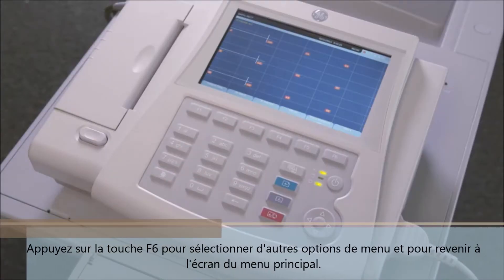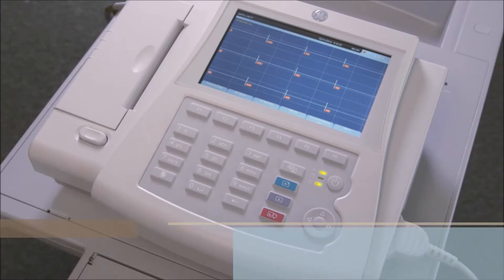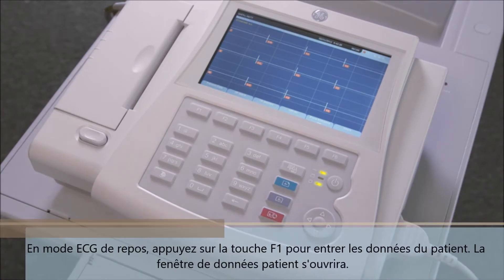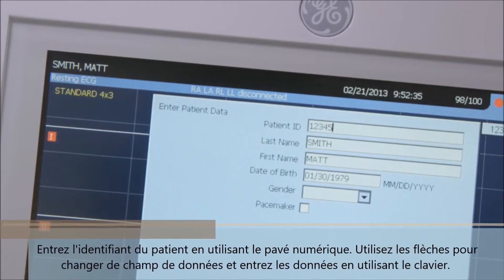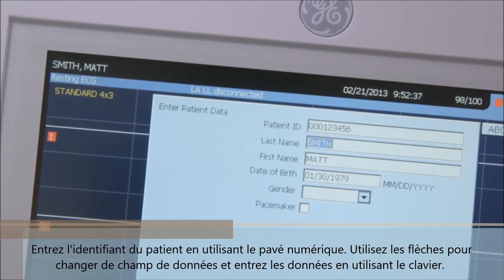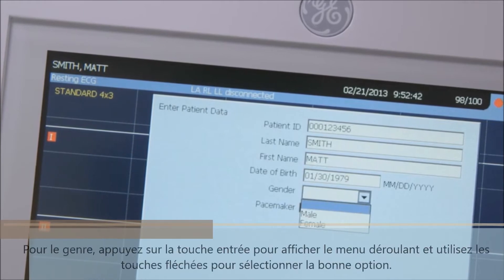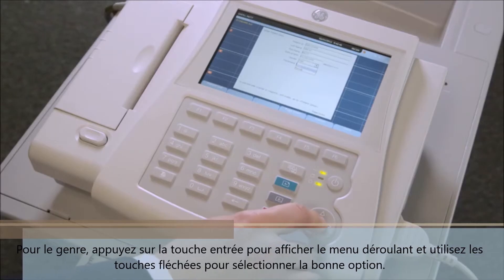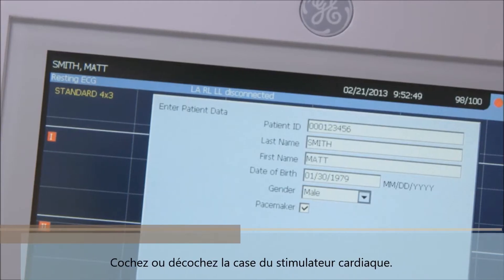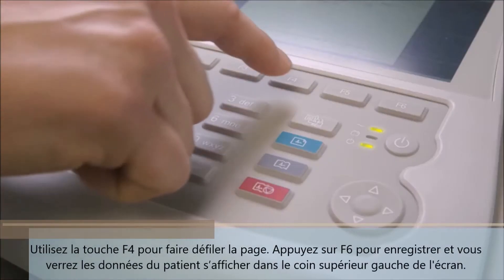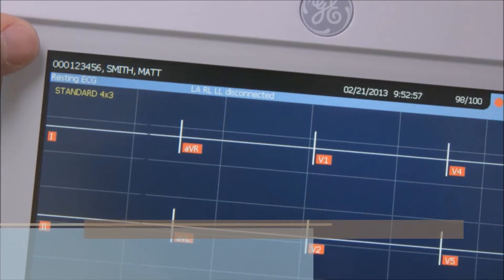Press the F6 key to select more menu options and also to return to the main menu screen. While in the resting EKG function mode, press the F1 key for patient data. The patient data box will populate. Enter the patient ID by using the numeric keypad. Use the trim pad to change data fields and enter data using the keypad. For gender, use the drop-down menu in the highlighted section and press the enter key to select options using the arrow keys. Check or uncheck the pacemaker box, and use the F4 key to page down.